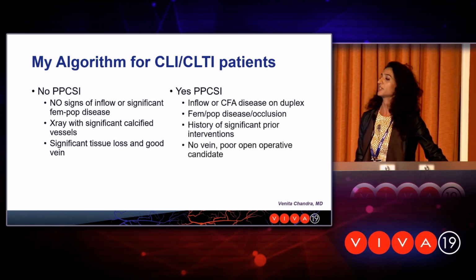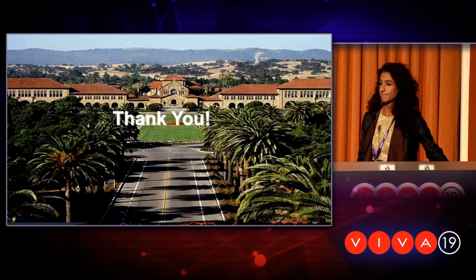I do get pre-procedural cross-sectional imaging, however, in patients with common femoral disease or inflow disease, FemPop occlusions, or significant prior interventions. And that's it.